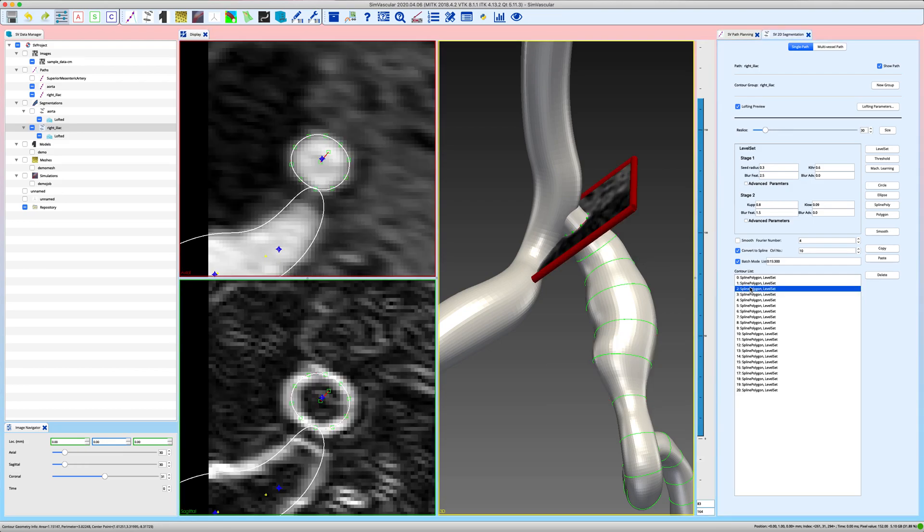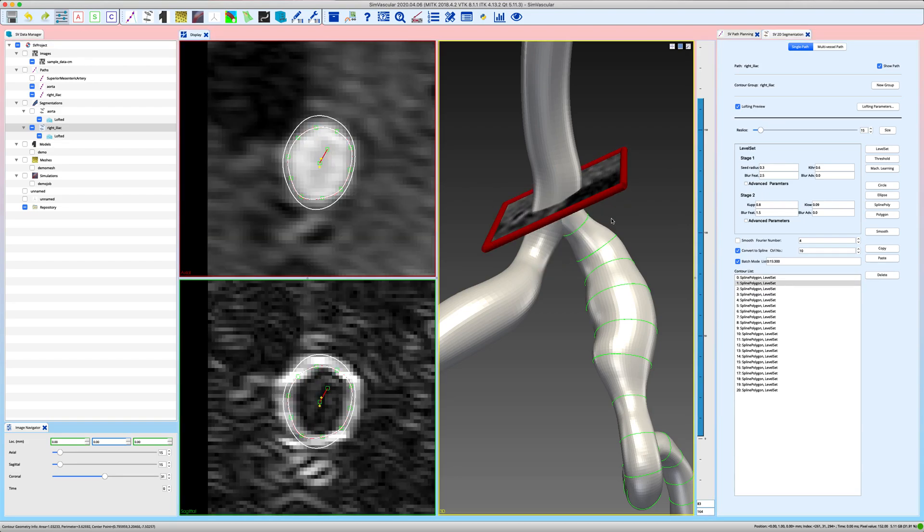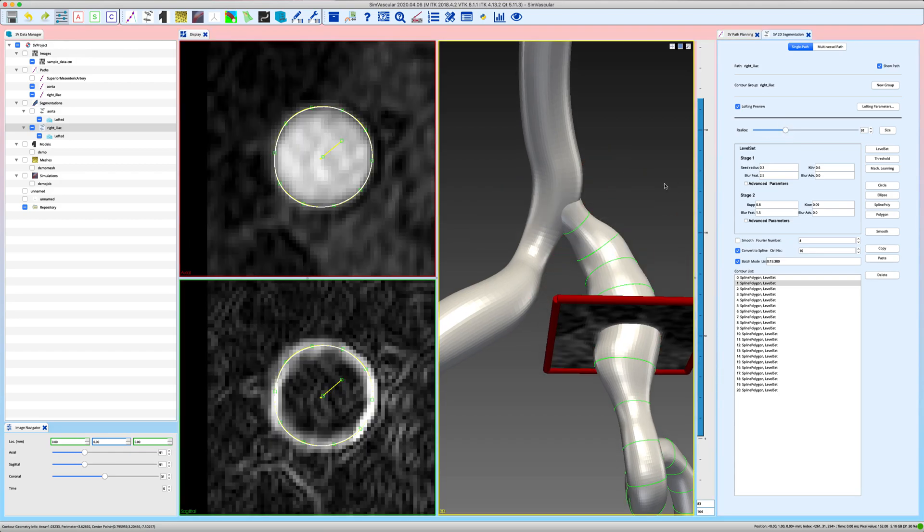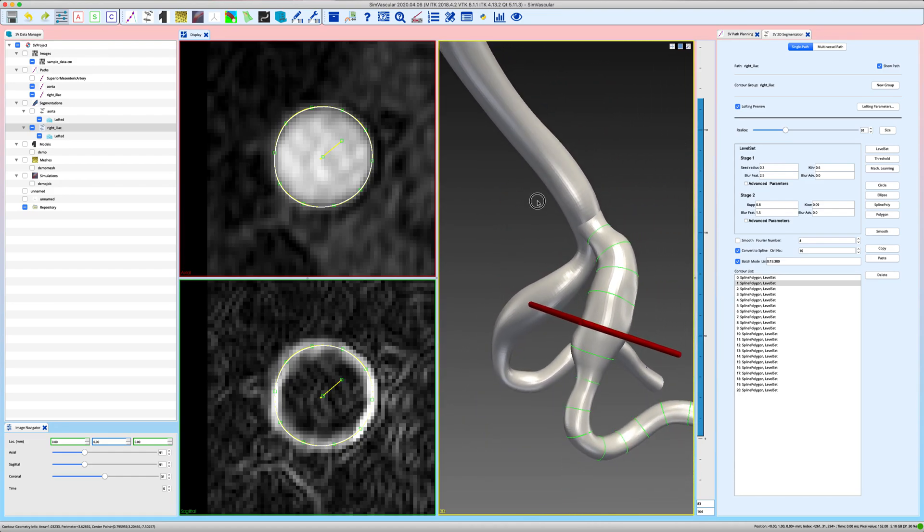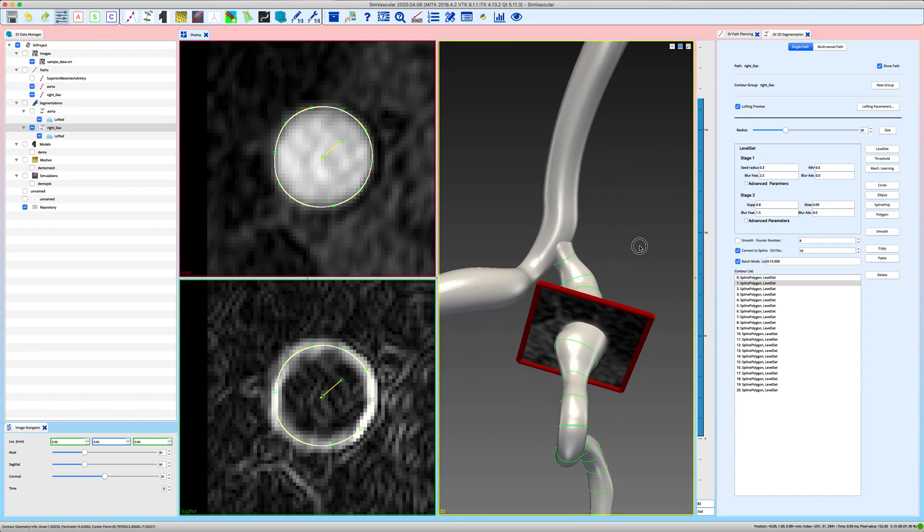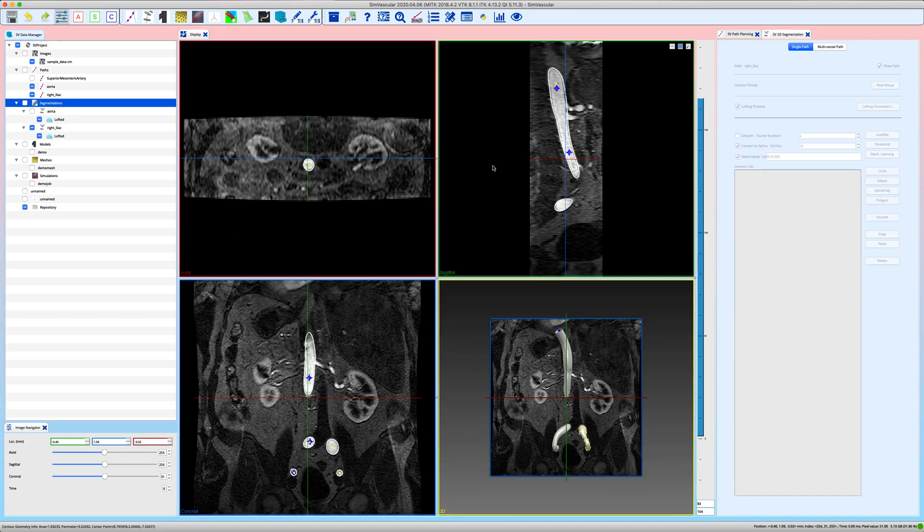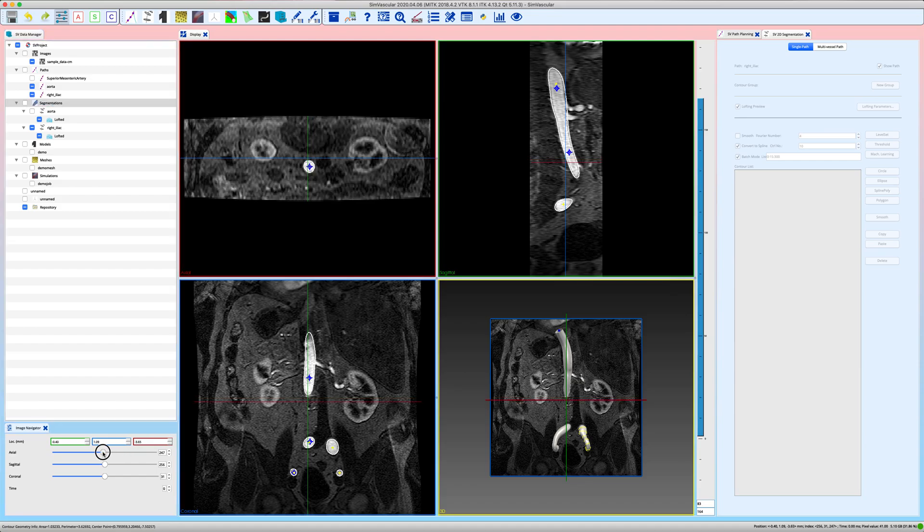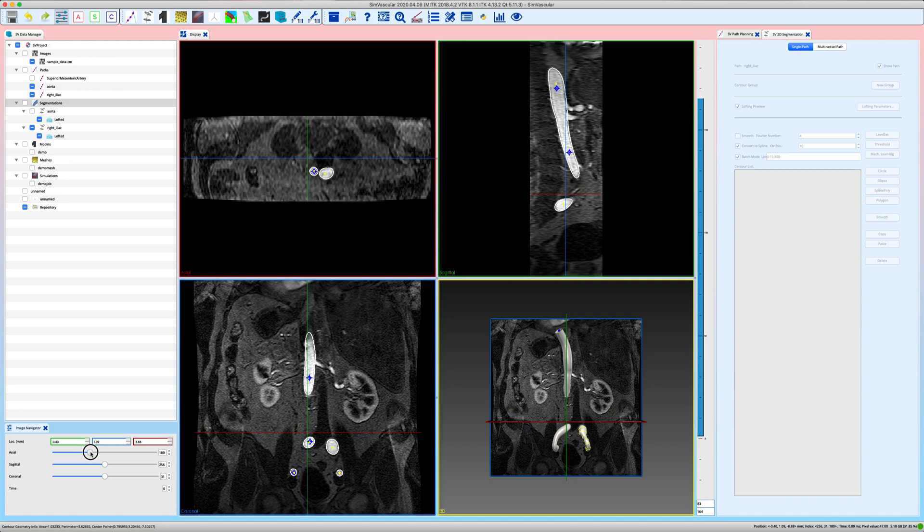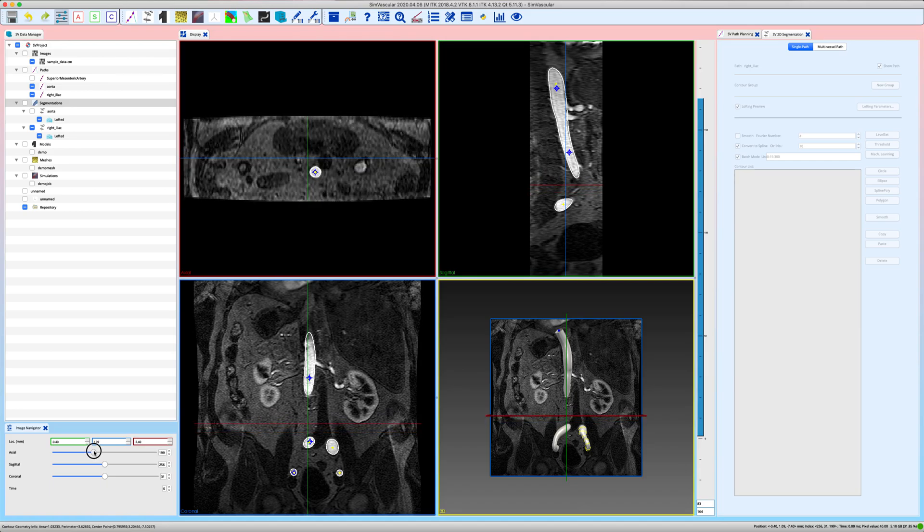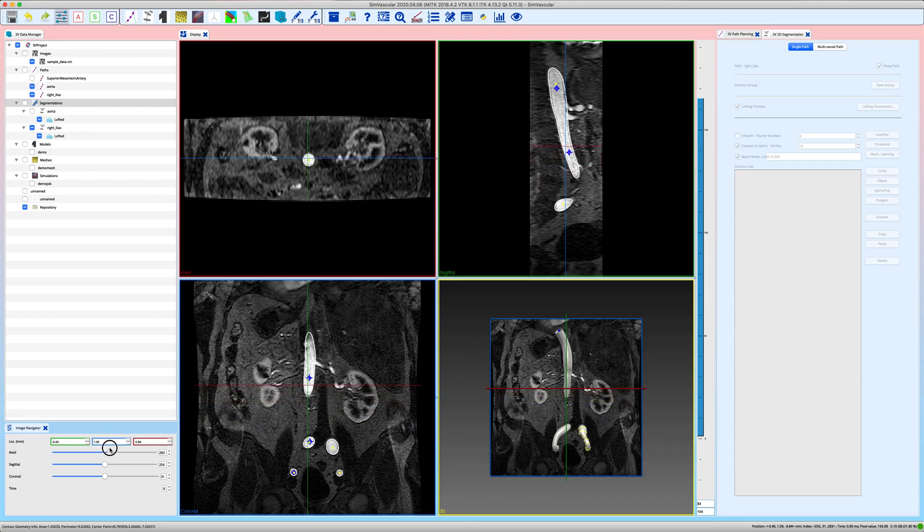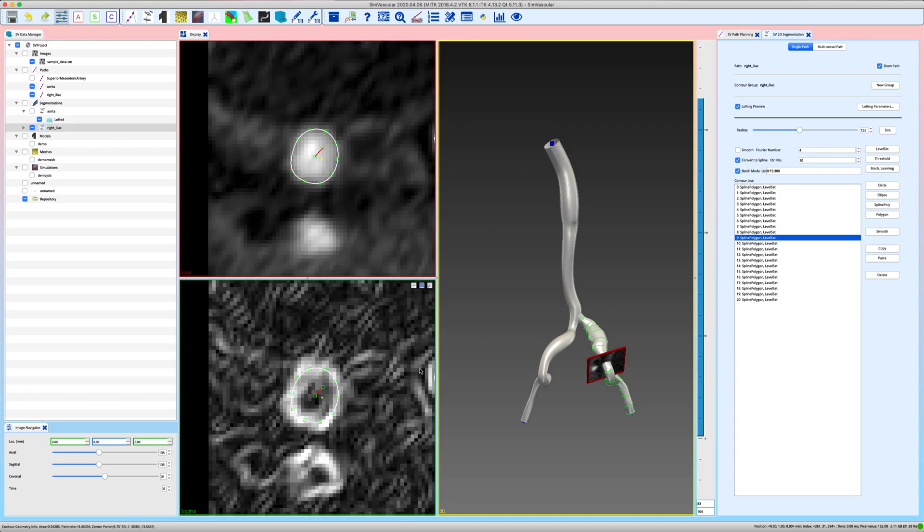And that looks pretty okay, especially because afterwards you can smooth some of these areas in the model building step. But say that if you're not happy, what you would do is you would maybe increase the size of this segmentation a little bit and see how that changes the intersection. Yeah that might be better. Okay, and a third possibility to double check on how your segmentations are doing and how the final model might come out is to go back into our four window pane and just use your axial view slider to see how the lofted preview of your segmentations and how they are doing at junctions or along all of the vessels. And anywhere where you are not happy with your segmentations just go back into the segmentation window and adjust any of the control points or add or delete additional segmentations.